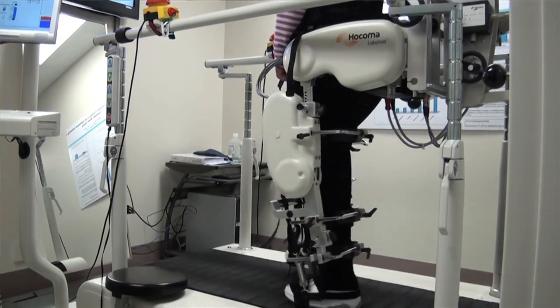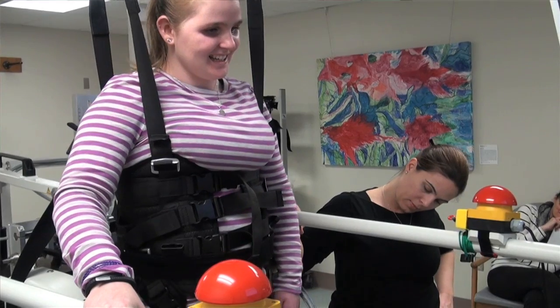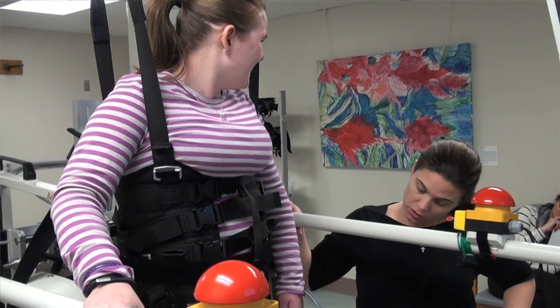We're able to see how much we're reducing the body weight support and how much we're changing the amount that the leg piece is bringing you through versus making you do it on your own. This gives us a more accurate, more objective judgment of how much that person is doing to take that step themselves.